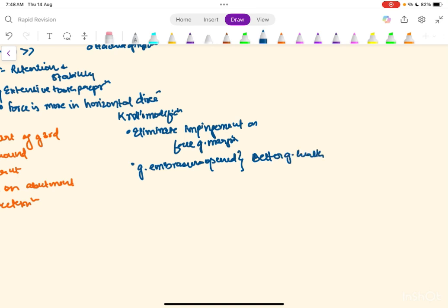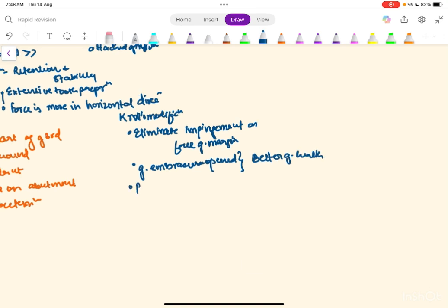Basically we will extend the proximal plate to the entire length of the proximal surface, and extend the guiding plane and proximal plate from the marginal ridge to the junction of the gingival third and middle third.